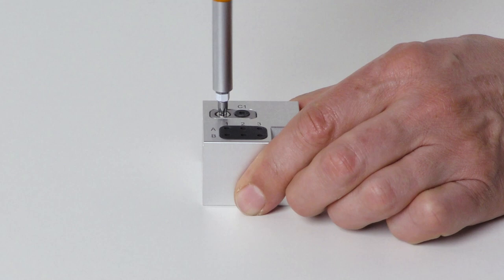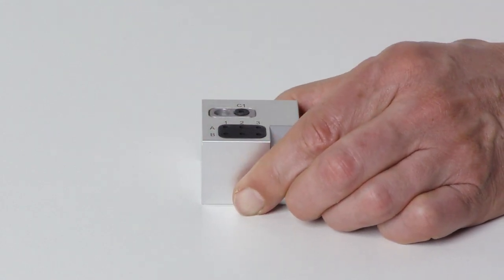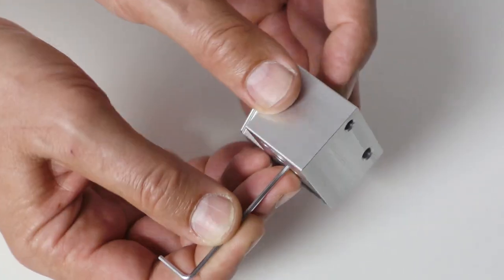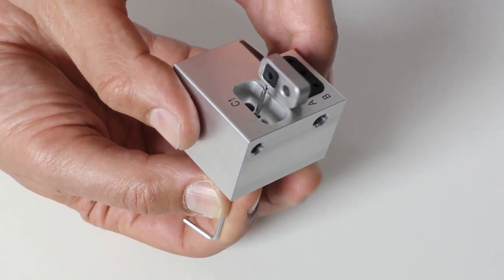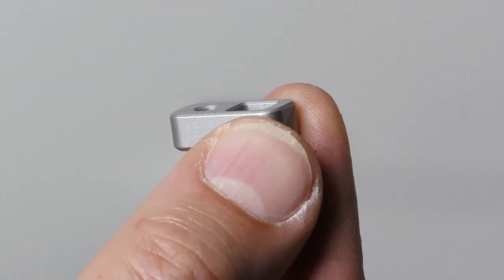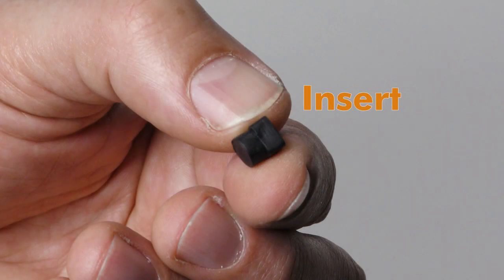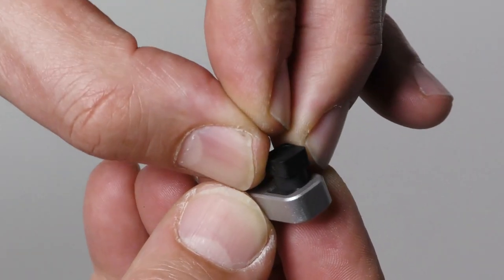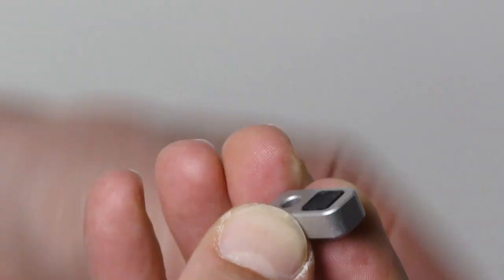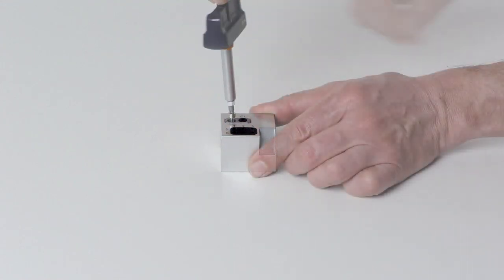Unscrew the screw to the left of the air tool insert. Push the holder out of the opening as shown. Push the insert out of the holder. Get the required spare parts. Push the air tool insert into the rectangular opening of the holder — the top of the insert is about 1 millimeter above the surface of the holder. Insert the holder into the opening and screw it down.